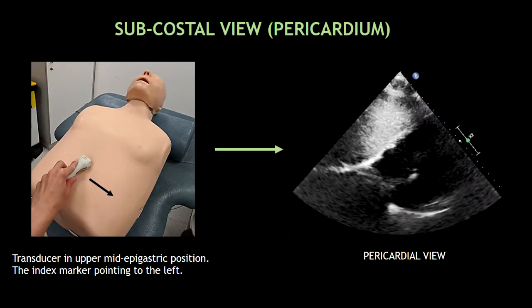First, I'm going to show you how to obtain this subcostal view. Here we usually visualize a four-chamber view of the heart. However, in this view we normally pay close attention to the pericardium. To obtain this view, we just have to place the probe in the upper mid-epigastric position, with the index marker pointing to the left.